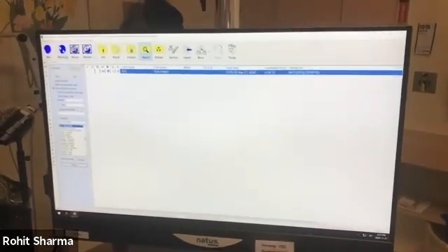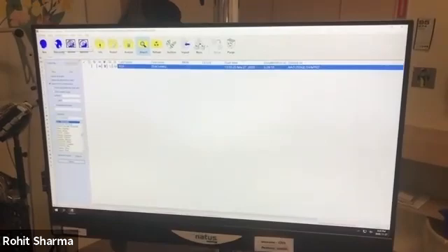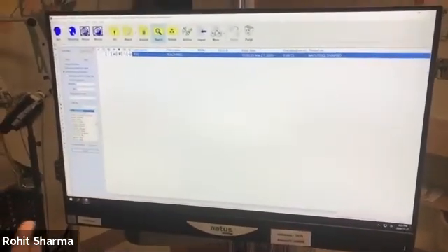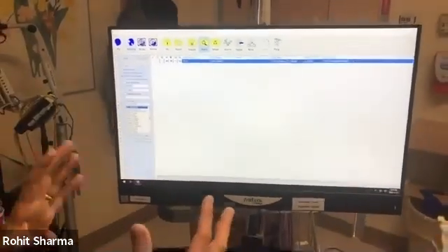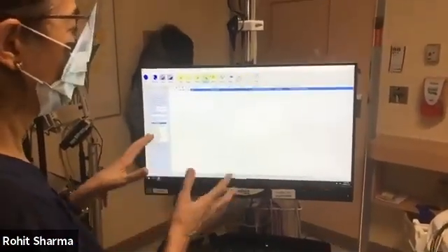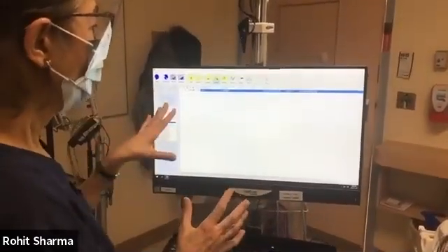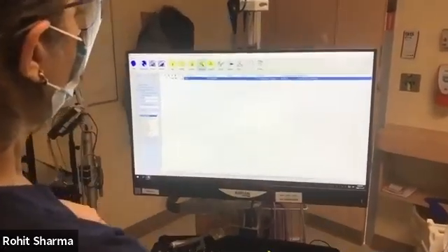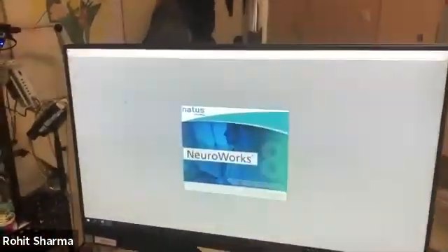So here we're back into the system again. And then you can just go back to say, when you move the patient from a different room, you can shut it down this way, or I'll show the other way. When you shut it down the right way, you can just come back and go back to the database that we said and just go returning.